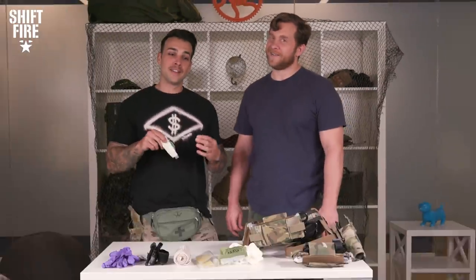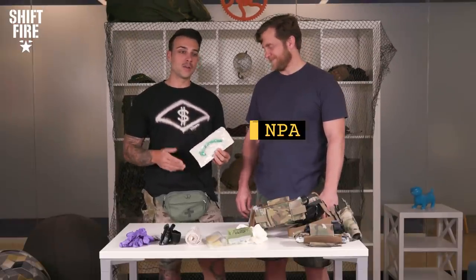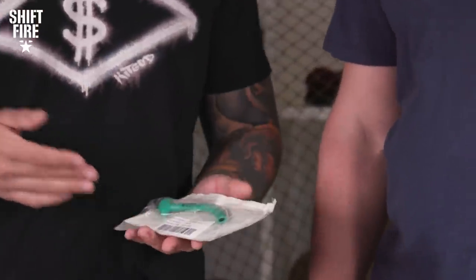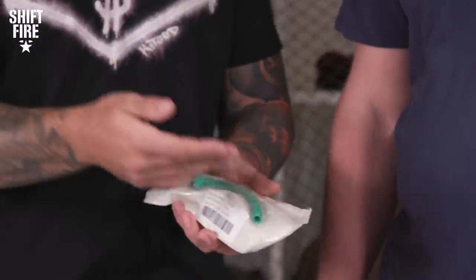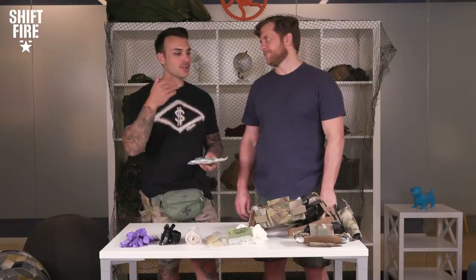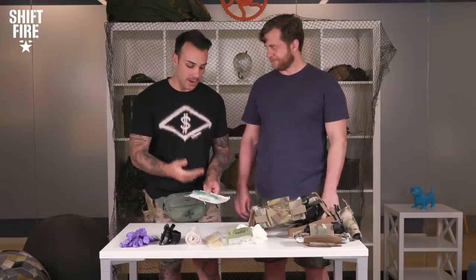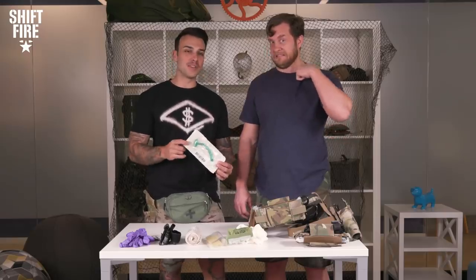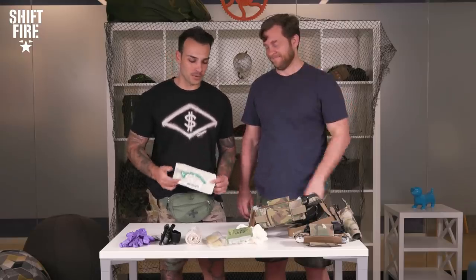Next is the NPA, or Nasal Pharyngeal Airway. This is a great tool to help clear someone's airway because if they're unconscious they might not be able to breathe. We're going to go into more detail in another video where we practice the application of the NPA, so stay tuned for that one.